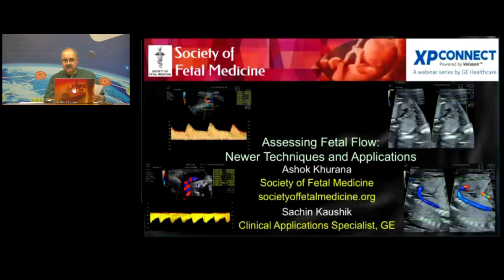I recognize the waveform. I will put my Doppler there and I will get my answer straightforward. I will use a PI because there is a reversal. As the fetus gets more and more anoxic or hypoxic, we realize that there is a reversal of flow in part of the cycle. And in the severely anoxic fetus, we have reversed flow throughout the cycle. Therefore, we said, okay, that is what we shall use for measuring. So we always use that portion of the three vessel view.